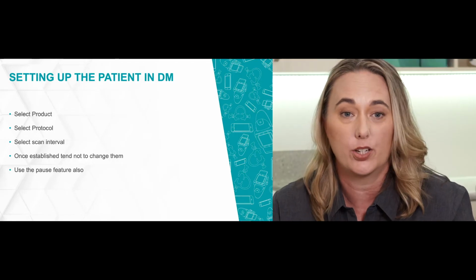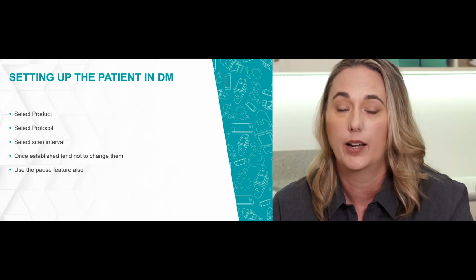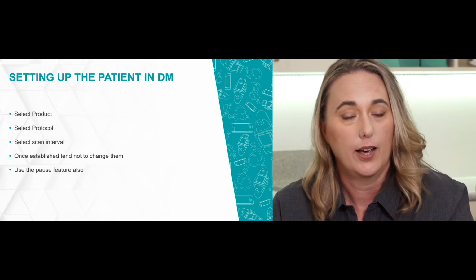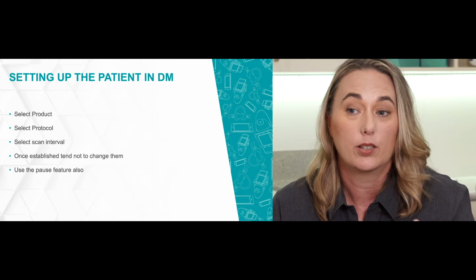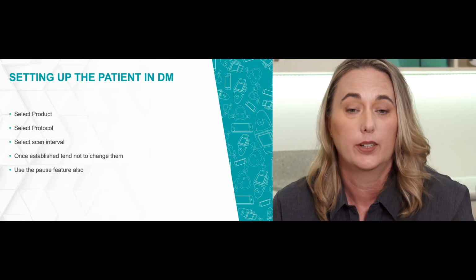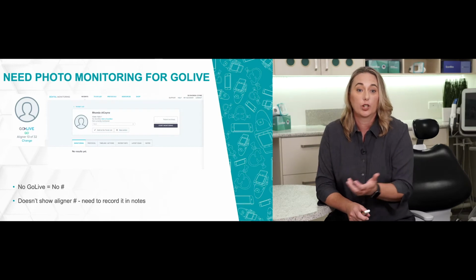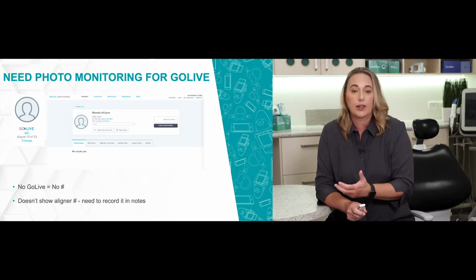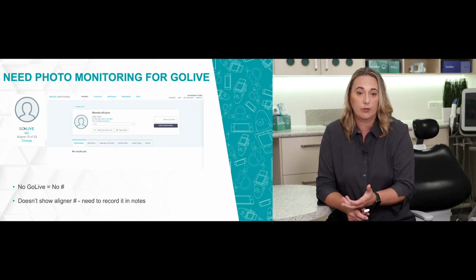So when we set up the patient in dental monitoring, you have to select your product and then the protocol and then also your scan interval. And often once these are established, we tend not to change them. Also, using the pause feature is a really valuable tool if the patient needs to delay scanning for a period of time. So you need photo monitoring for go live, because if you don't have it activated, the patient is not going to get their dynamic aligner change information.